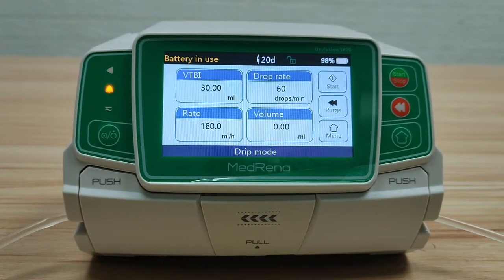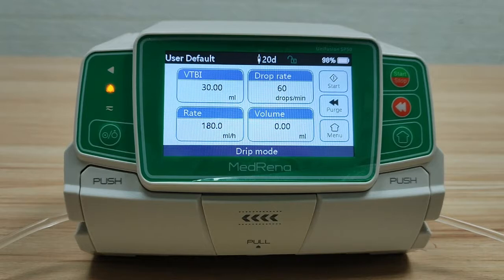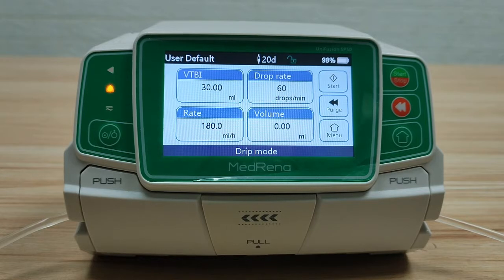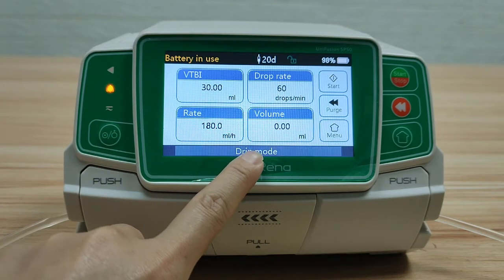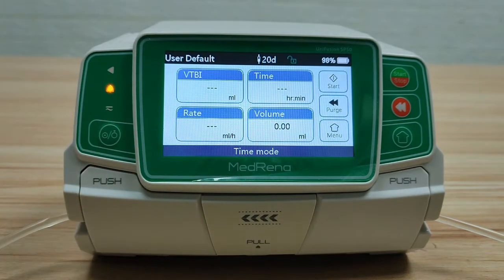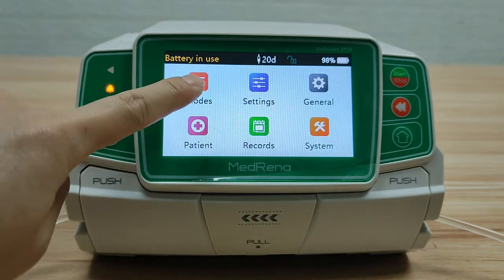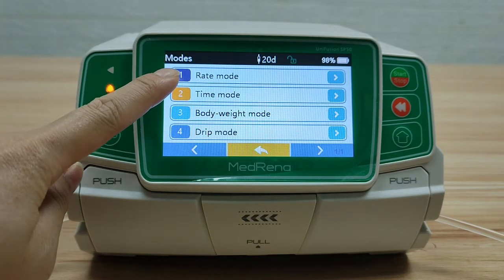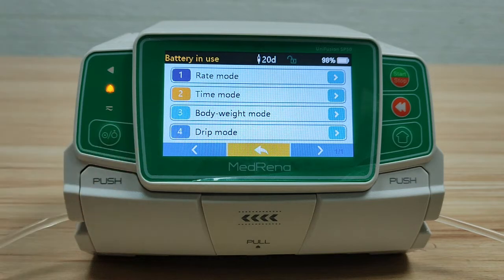Third step: select infusion mode. The current infusion mode can be found at the bottom of the display. There are two ways to change it: the easiest way is to touch the current infusion mode at the bottom of the display and select your preferred mode. The other way is to press Menu, select Modes, and choose your preferred mode. There are four different infusion modes: Rate Mode, Time Mode, Body Weight Mode, and Drip Mode.